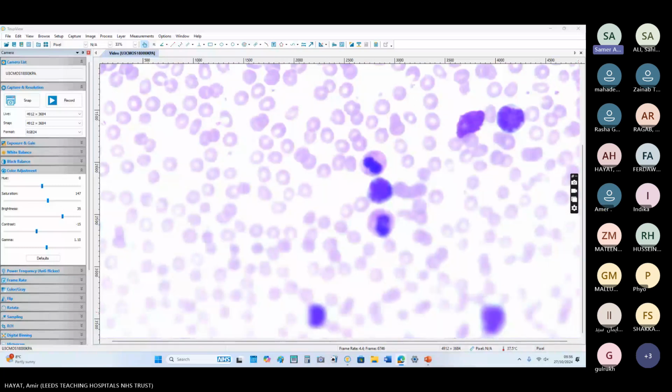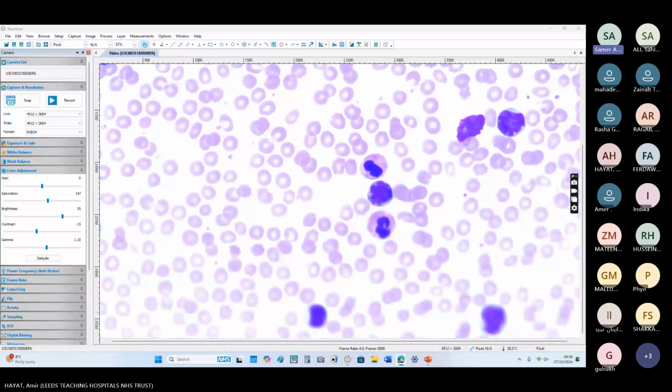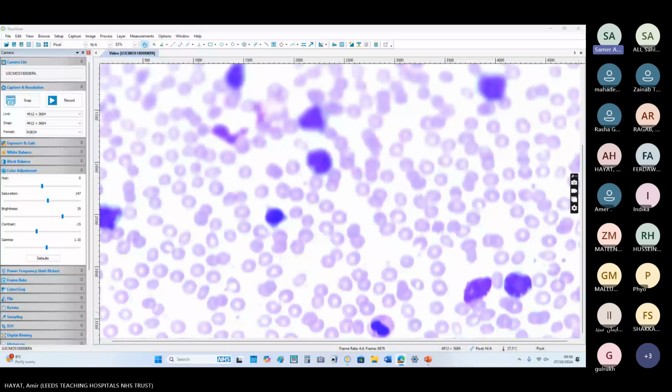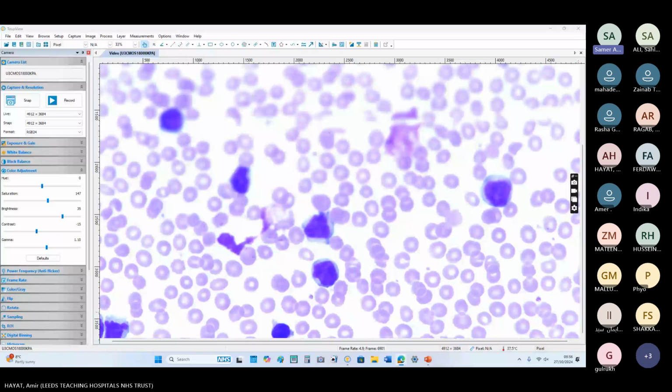Yeah. So in the blood film I will start first by saying there are some red cell changes. I will start with this one, although I know that the elephant is in the room. The red cells show some microcytes, some spherocytes, and platelets look morphologically unremarkable. In the white cells, I would say there is a leukocytosis with medium to large size cells.